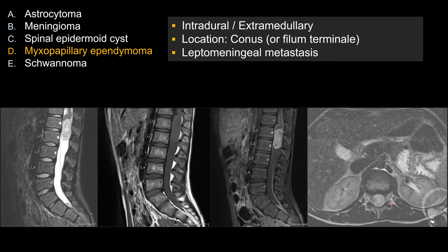On the axial view, you can confirm that it is intradural, and you don't see expansion out into the neuroforamina.